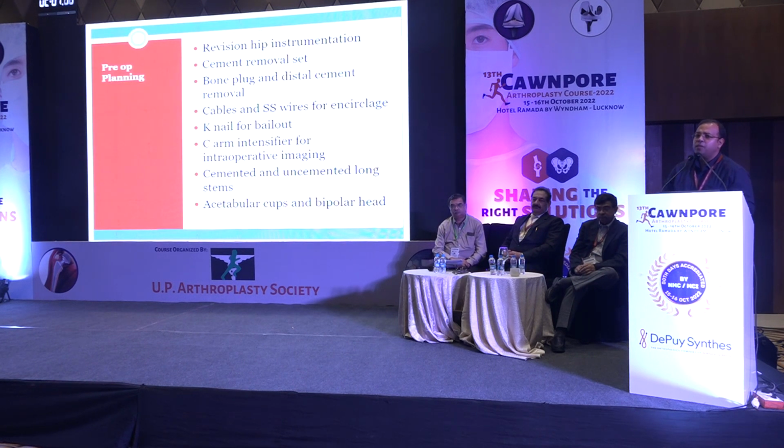So for pre-op planning, we had everything on the set, revision hip set, cement removal. I always keep a K-nail for my bailout, because in my experience in a few previous cases, sometimes they splinter so much that you have nothing to work with, so instead you wire it, put a K-nail, and then come back for a normal revision with a tube which is formed after the union.